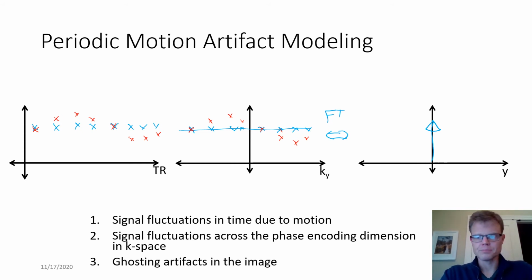So we can generally represent that, for this point object case, as the normal data plus some term representing the oscillation.